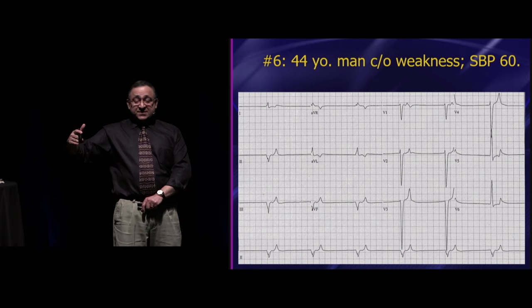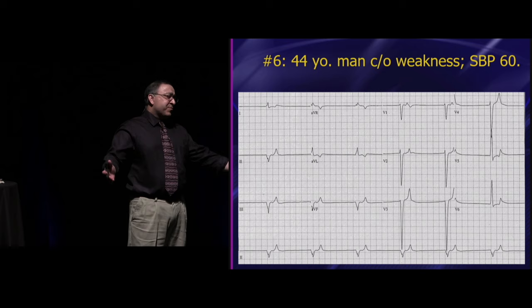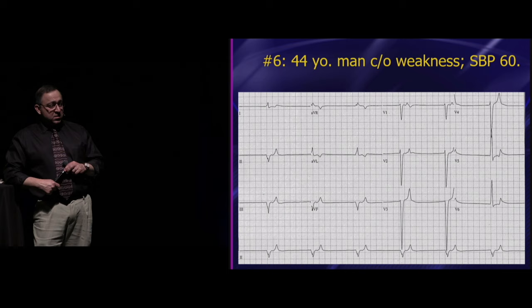What if I told you that this patient got some atropine and it didn't work? Well, no surprise, ventricular escape rhythms are not vagal, so atropine's not going to work. What if I told you that transcutaneous pacing was attempted and didn't capture? Which is what happened.